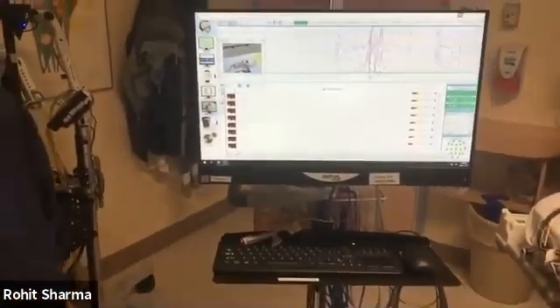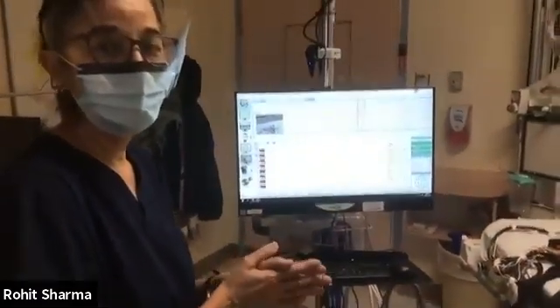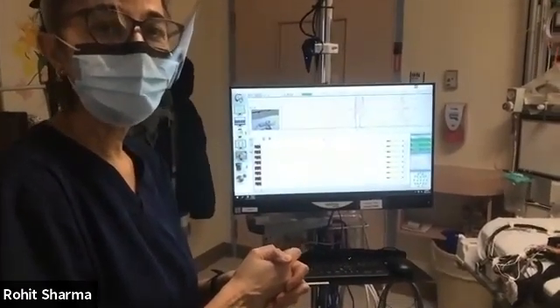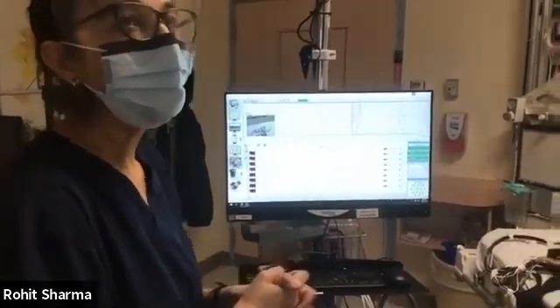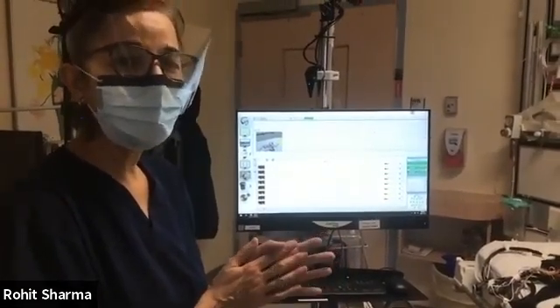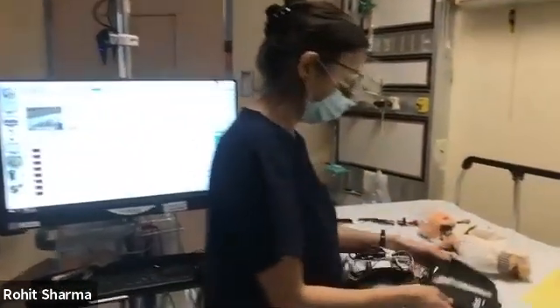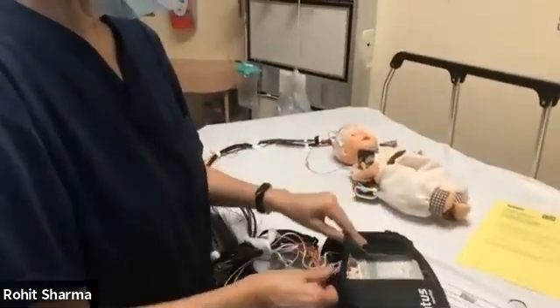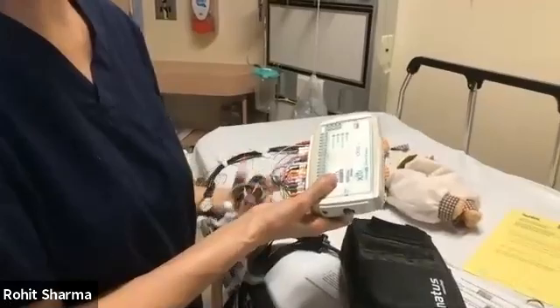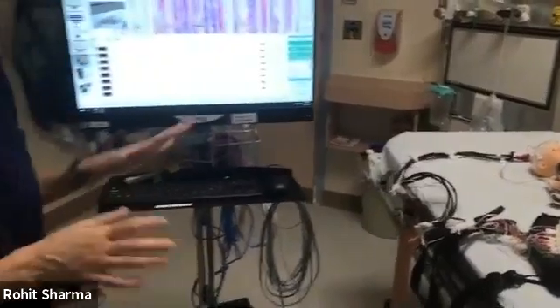Is there anything that I haven't covered, guys, you'd like to ask? Somebody said, how do you clean the electrodes? Okay, so these are disposable electrodes. We don't actually clean them. The entire electrode from the top of the head to the ones in the jack box here, all the way down to here, they're actually disposable. We do not use these electrodes again. We don't need to clean any of them.